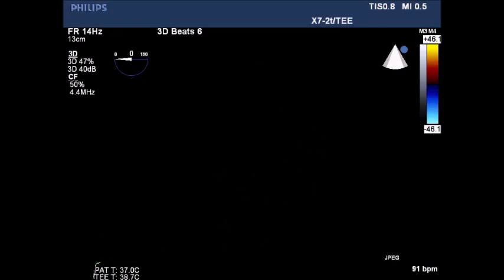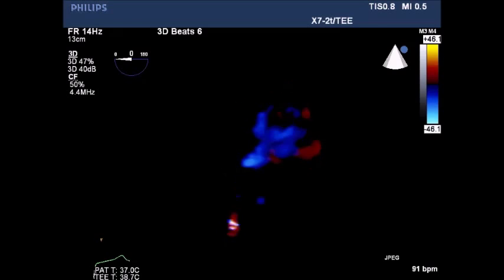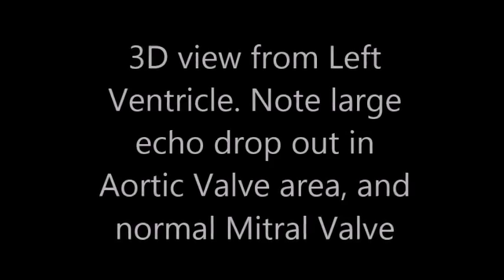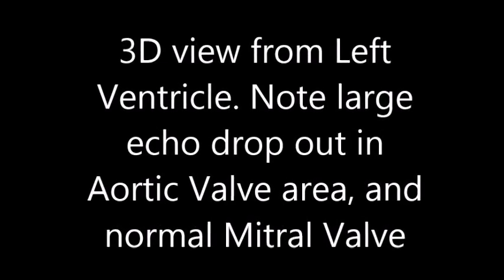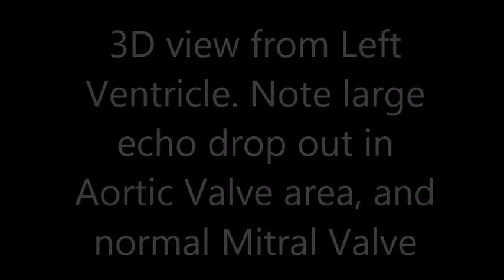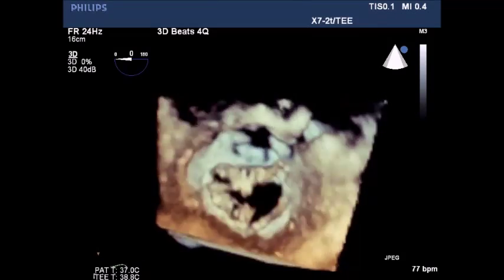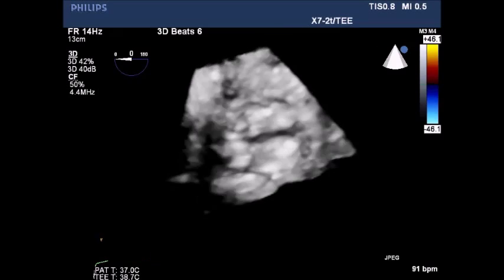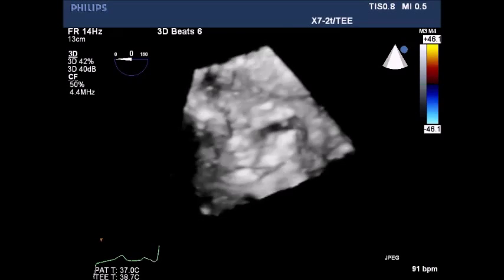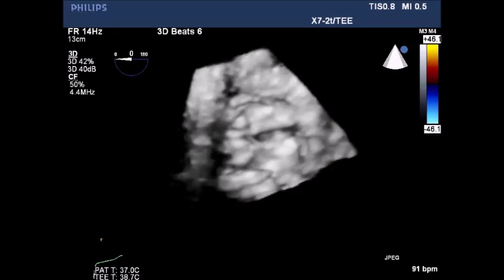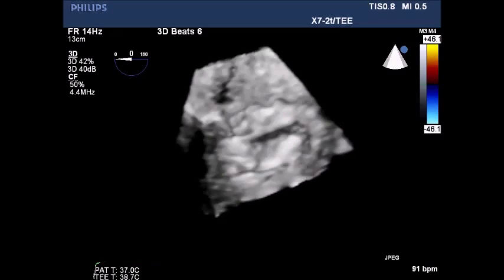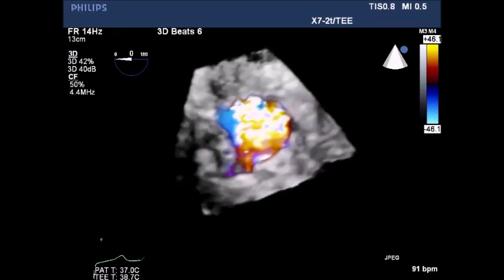Continuous color flow Doppler demonstrating repeated regurgitant flow across the aortic valve throughout the cardiac cycle.